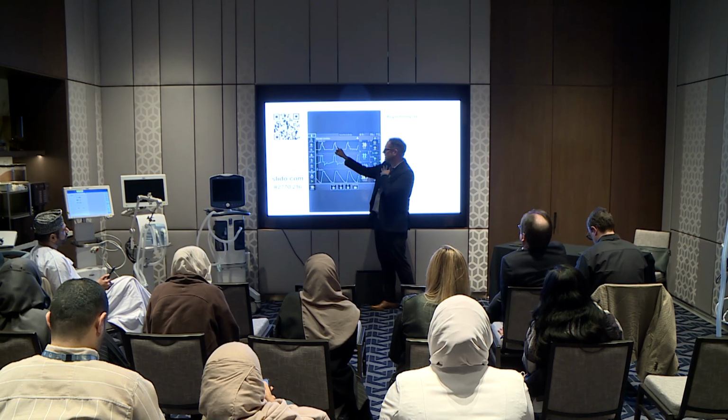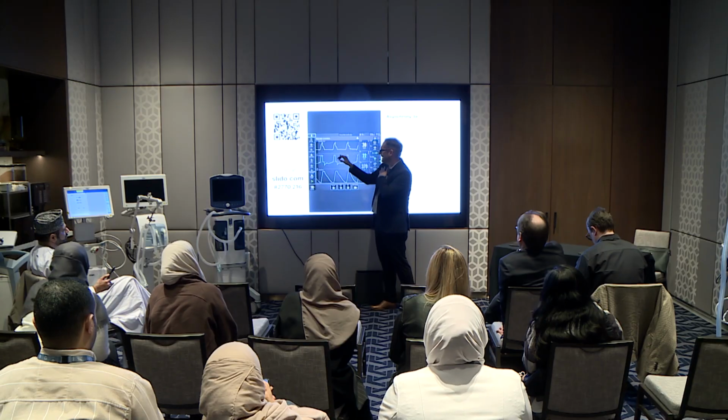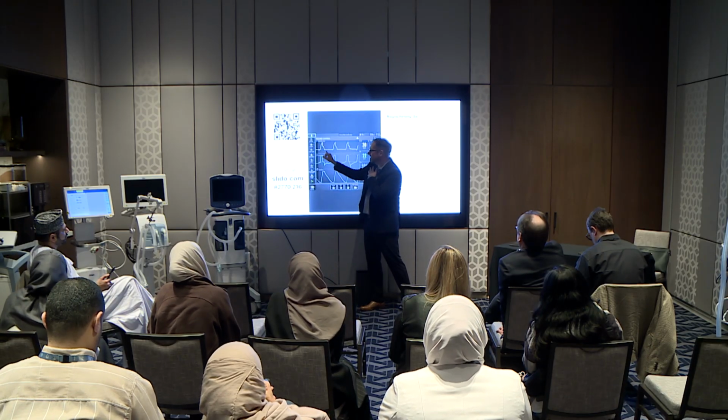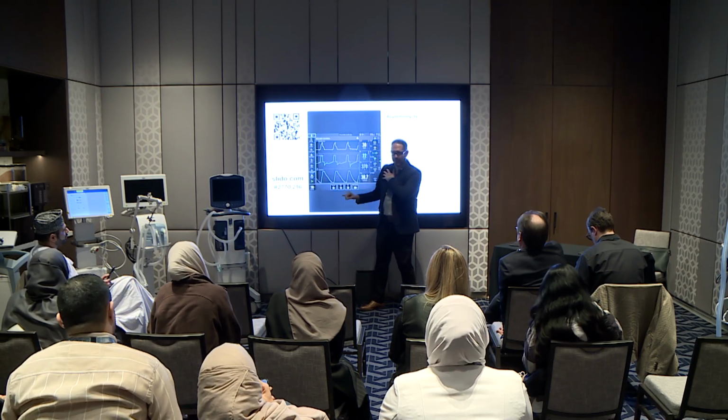What does that tell you? There's a drop in pressure. In the inspiratory pressure, this is volume control, I see a drop in pressure, but it's not here now, right? It's not as obvious. There's a loss of plateau and this ongoing effort.